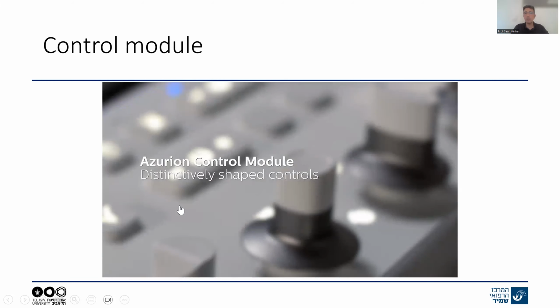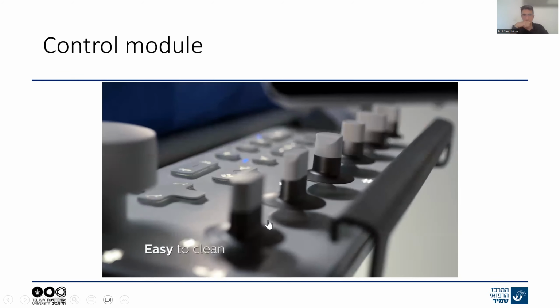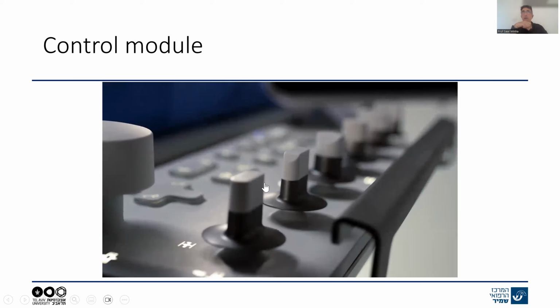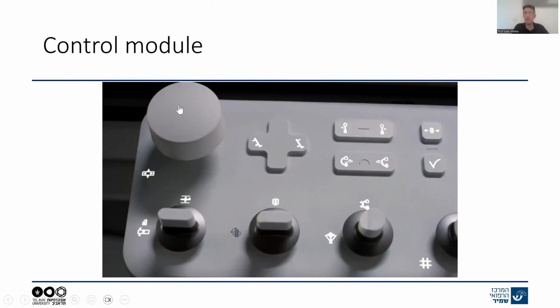And again, just to demonstrate the control module, this is a very simplified manner of demonstrating how easy the knobs and the different tools that you have are, and Philips engineers also used light in it. So this big knob here, when you put your hand on it, you can move the table back and forth, left and right. You can put your C-arm in and out. This V sign, I will show the touchscreen in a second, but when you hit it, it just goes to a designated safe projection.